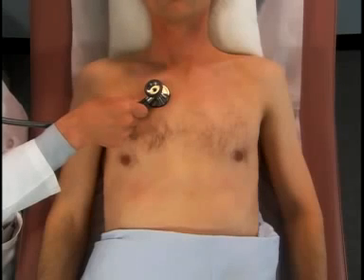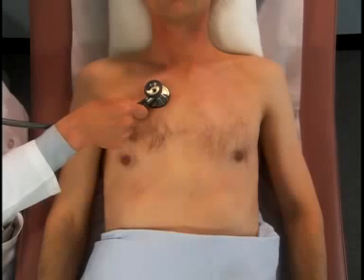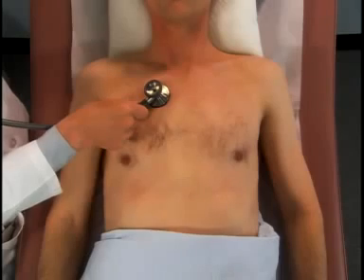Identify S1 and S2, and listen for extra heart sounds and murmurs. Murmurs are covered in greater detail later in this video. In the aortic area, and also in the pulmonic area, S2 is usually louder than S1.